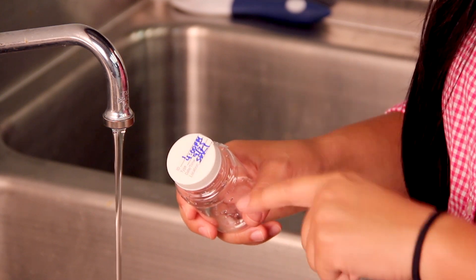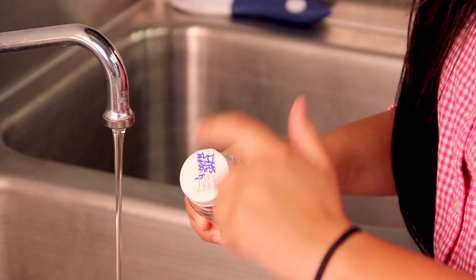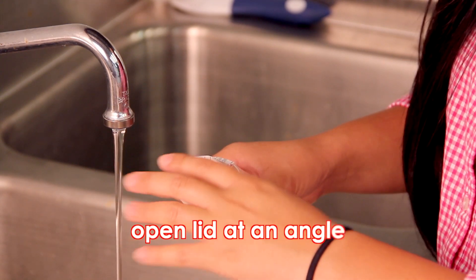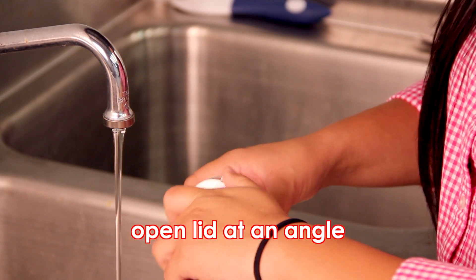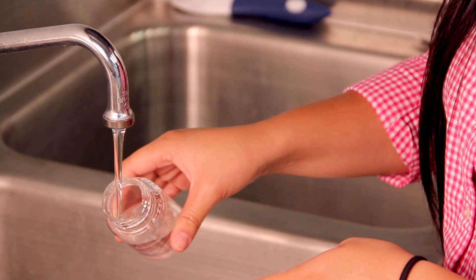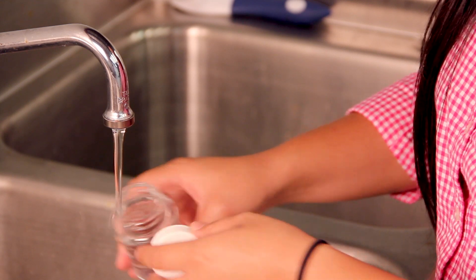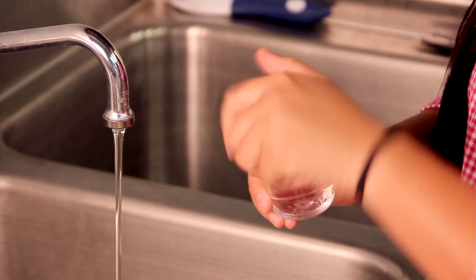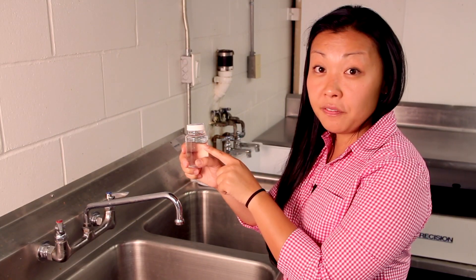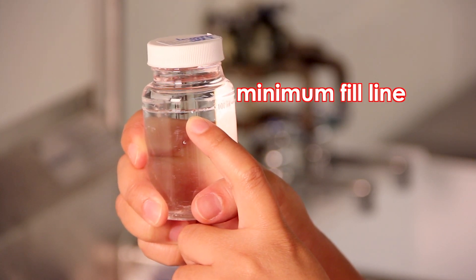It's very important that you do not contaminate the lid. Break it open and when you open it, open it at an angle. Put it right under the water flow and fill it to the minimum line. You'll notice there's a fill line — at minimum we need that much, but if you can put more, that would be even better. Then close it right up.